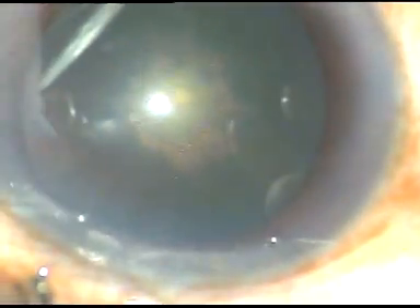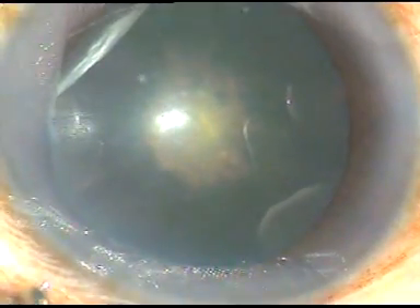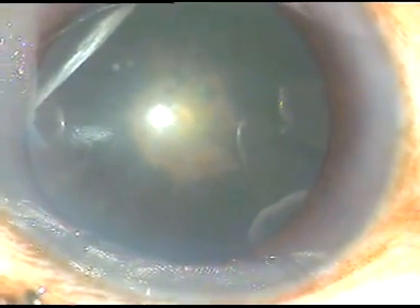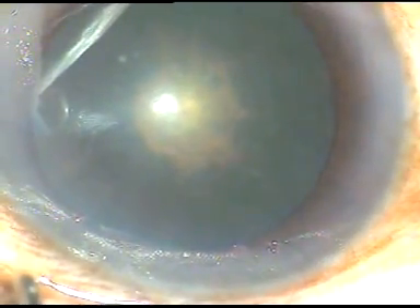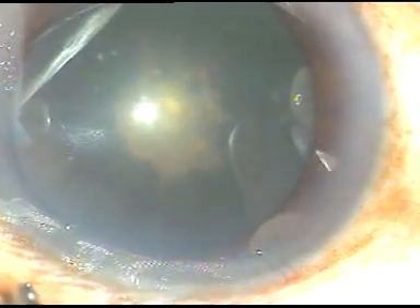This is a posterior subcapsular cataract. The nucleus is very soft in this case. So I have decided to employ my lens tilt technique.